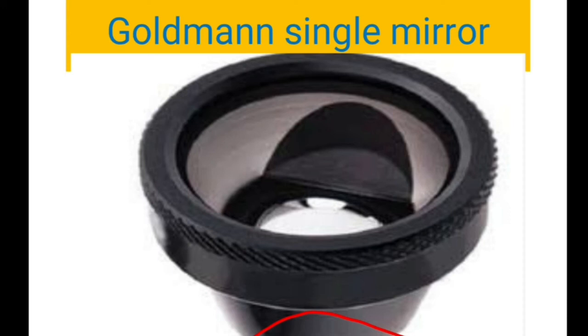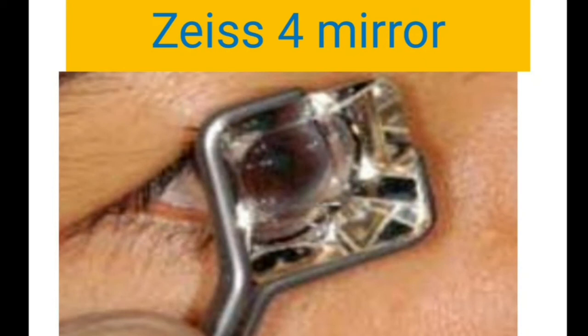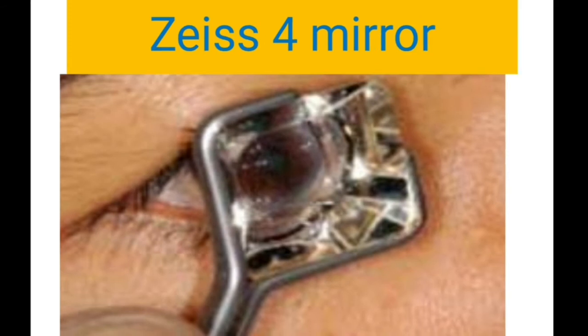So this is what you do in Goldmann's types of goniolenses. Whereas in case of ZEISS mirror, just anesthetize the cornea. There is no need of coupling fluid. Then you just place the lens and examine the trabecular meshwork.